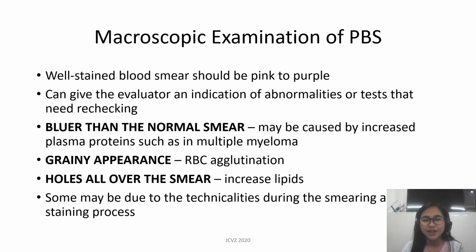Then, if your smear has a grainy appearance macroscopically, that could mean that there is RBC agglutination, meaning to say that your RBCs are clumped to each other, or they form in groups. And if your smear has holes all over it, it could mean that there is increased lipids.